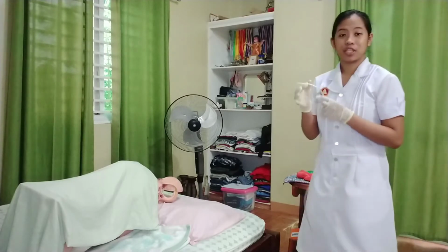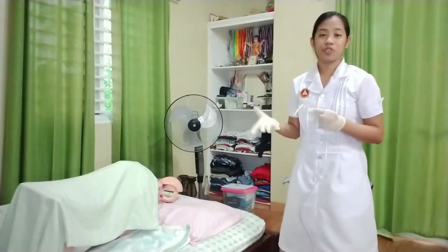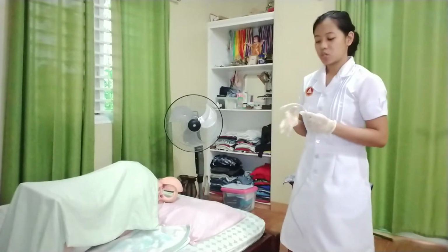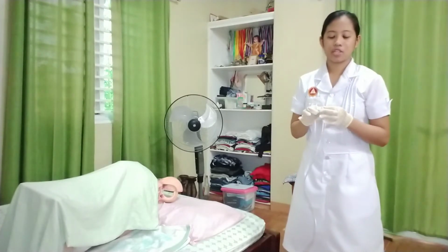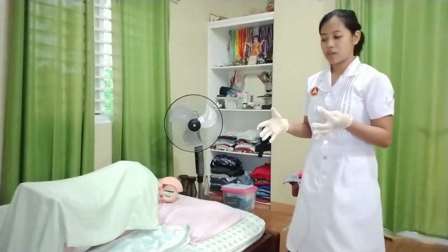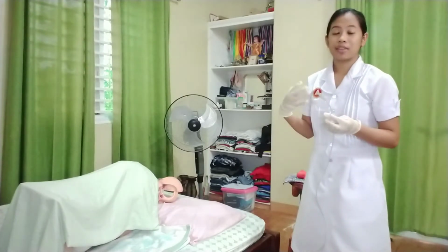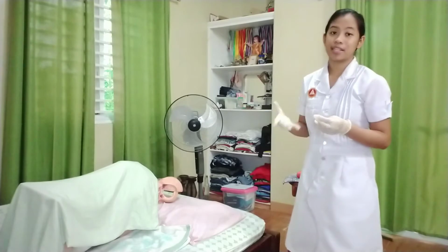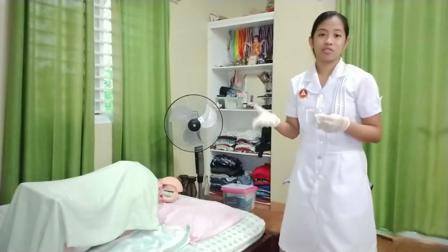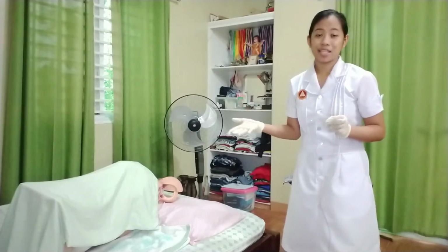So I will be inserting the tube into the rectum about 3 to 4 inches smoothly and slowly, directing towards the umbilicus. So in inserting a tube, we should always remember that we should never force it. If resistance is encountered in the internal sphincter, let's ask our patient to take a deep breath and we will run a small amount of solution through the tubing.